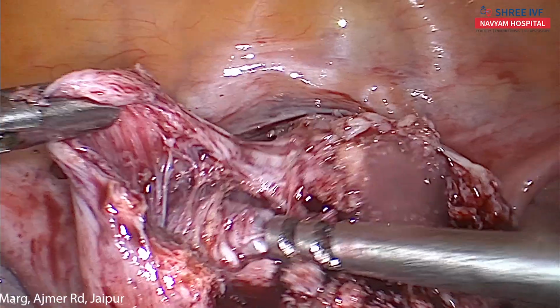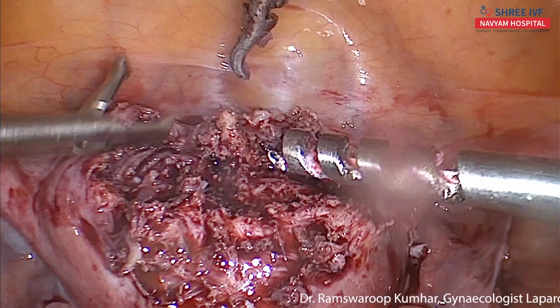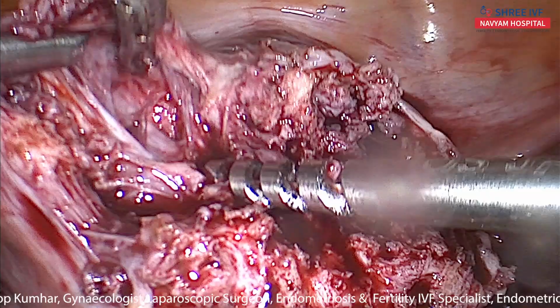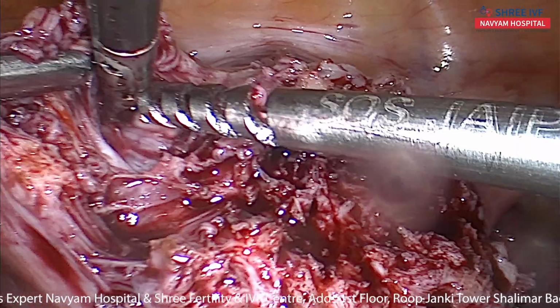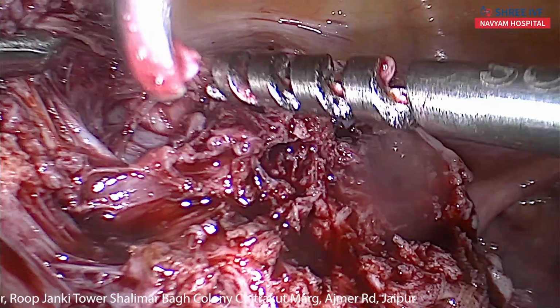We have to apply the same principle for all myomas, and the principle remains the same. Traction and counter traction and proper plane.